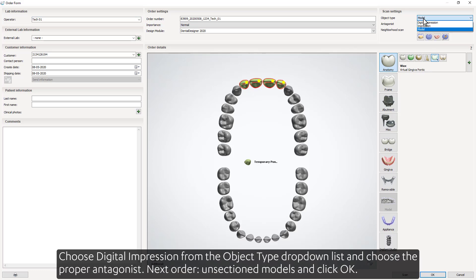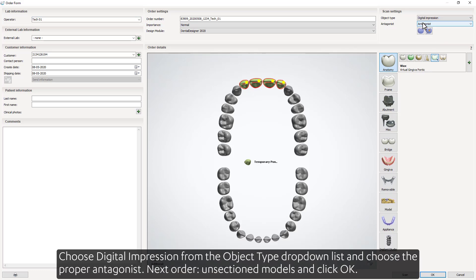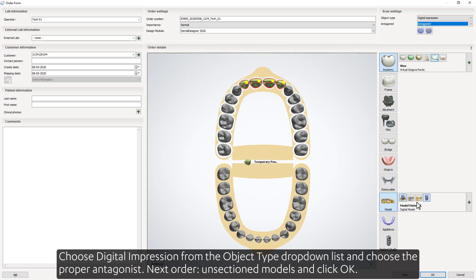Choose Digital Impression from the Object Type drop-down list and choose the proper antagonist. Next, order unsectioned models and click OK.